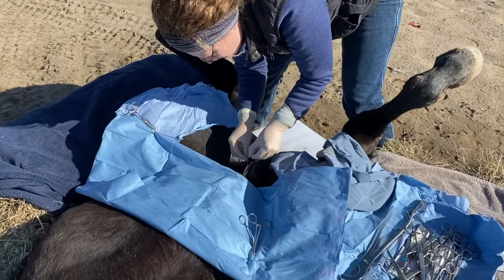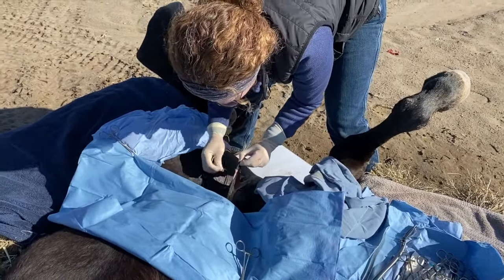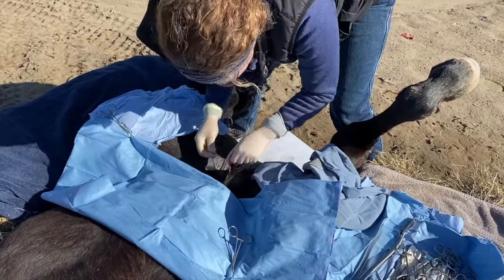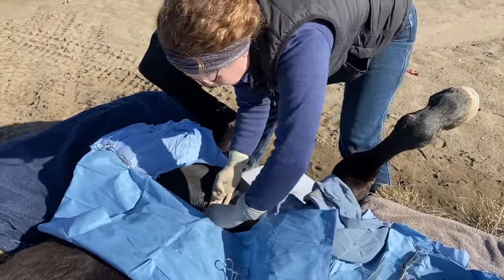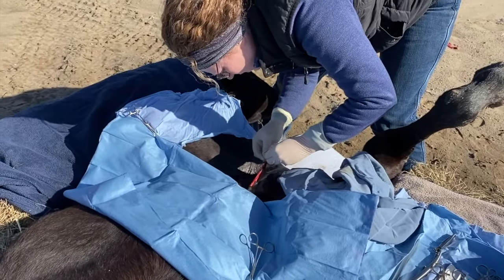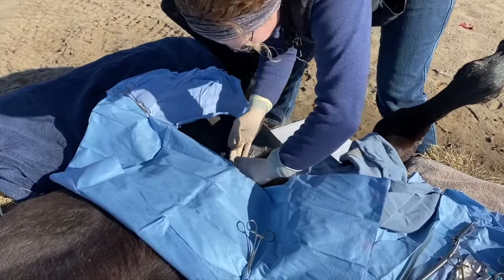Various accepted surgical methods and approaches exist for an equine castration, depending on veterinarian preference, patient age, breed, and size, and the available operating environment. I begin the surgery with one midline incision to gain access to both testicles and the scrotum. A small amount of scrotal skin is purposely removed with the incision, which will help improve post-op drainage.